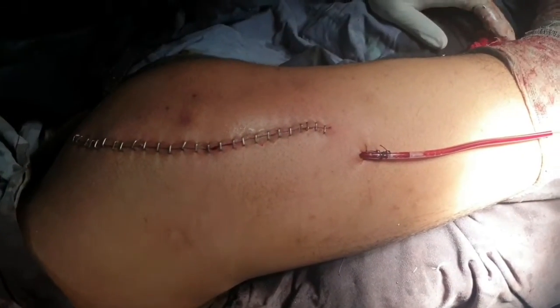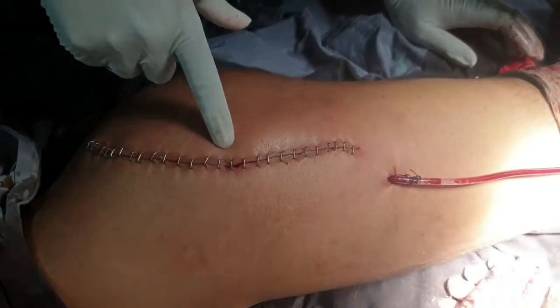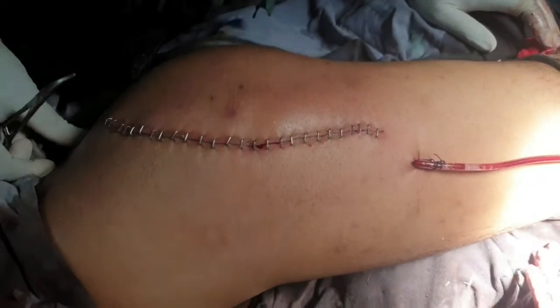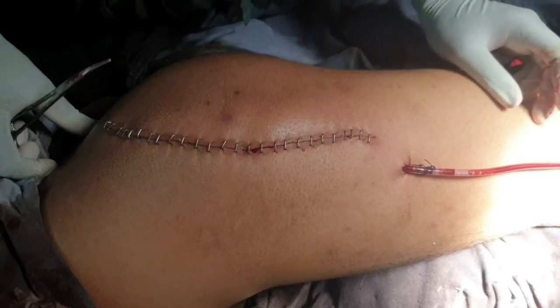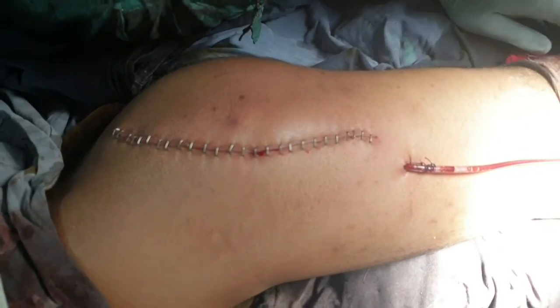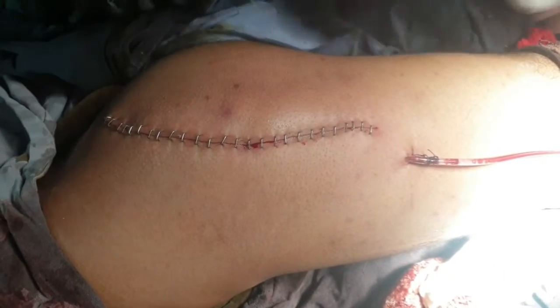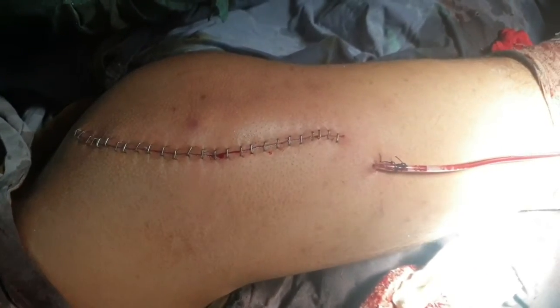So this is the final closure. This is the incision. Here is the posterior superior iliac spine. So this is our standard Kocher-Langenbeck approach. So thank you, and thanks to the team for the nice operation.